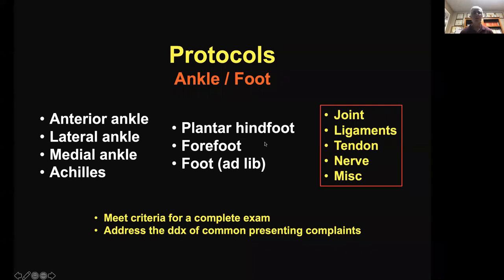So for example, plantar hindfoot, someone with plantar fasciopathy. Of course, we're going to look at the plantar fascia and other plantar structures, but I also look at the medial tarsal tunnel because that fulfills several purposes. The first is that oftentimes plantar heel pain can come as radiation from the medial tarsal tunnel or can coexist. And secondly, I'm looking at joint, I'm looking at neurovascular structures when I'm looking at the medial tarsal tunnel, again fulfilling criteria for a complete exam.